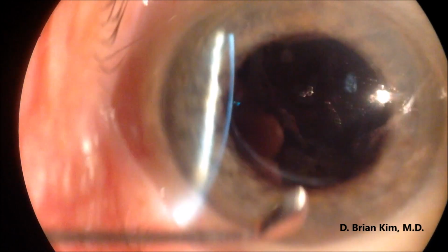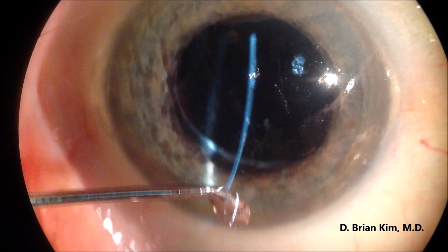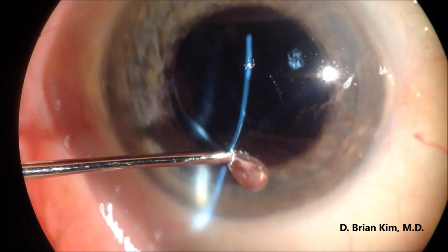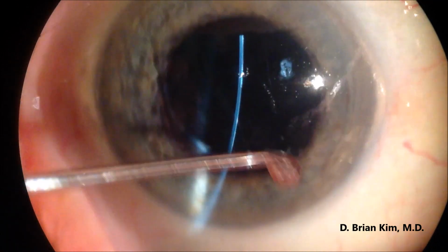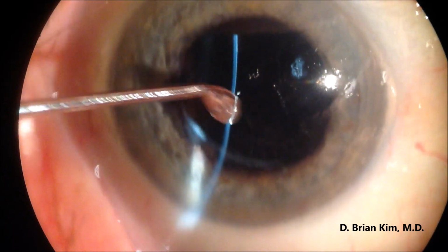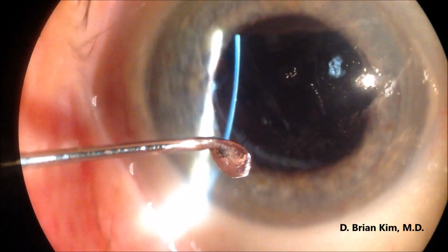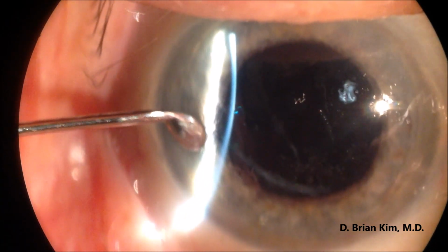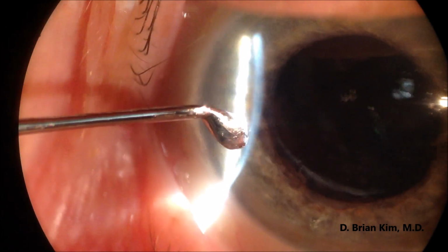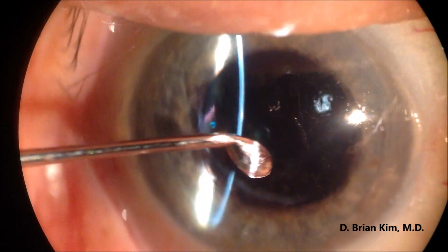And so what you do is use the back side of an instrument like this. You basically touch the cornea, just very gently. You just kind of gently touch. And there's no area right now that I see that's loose.